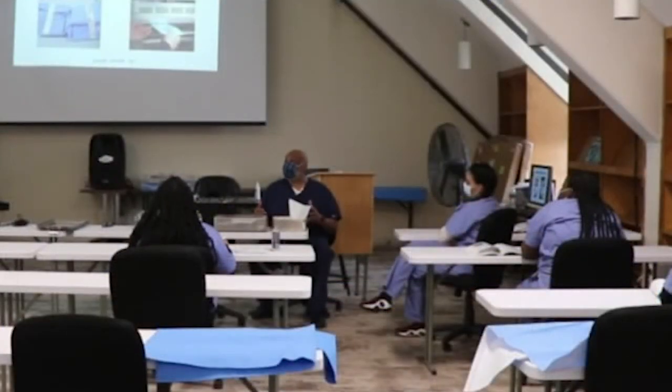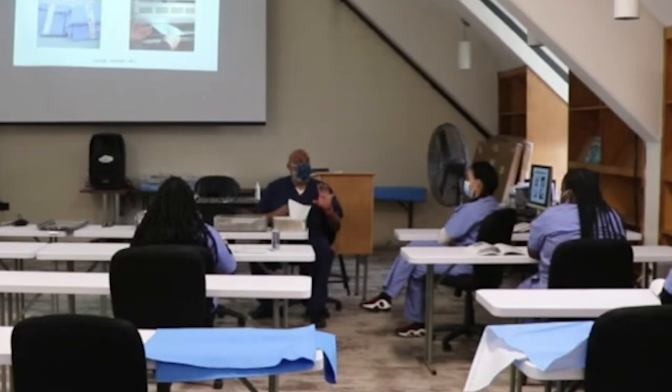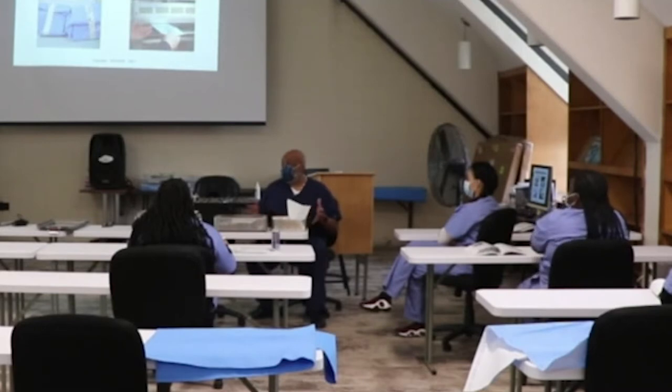The balancing act with you guys in sterilization is to make sure your goal right now at 4 o'clock is first deferred. You're always pushing for your first two cases the next day. When we wonder what drives our priority, those priority trays are your one-of-a-kind trays and your heart trays, your transplant, your brain trays, trauma. There are certain trays that we always, let's go to Presbyterian, we're at Einstein. Any of your trauma hospitals, they have to have those trays ready, okay?